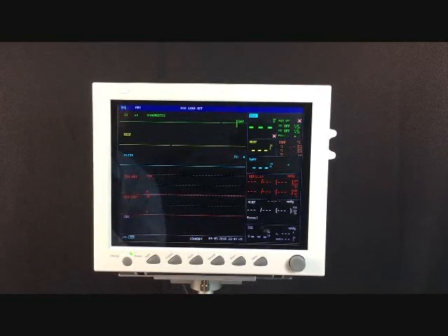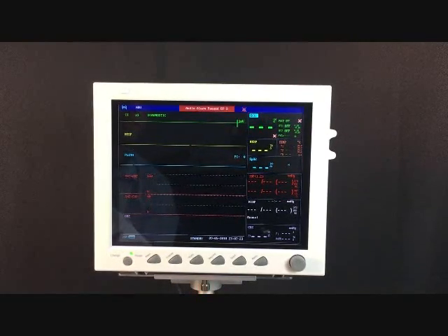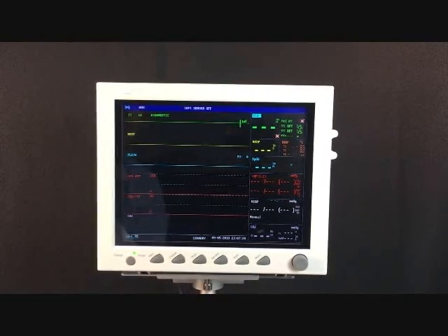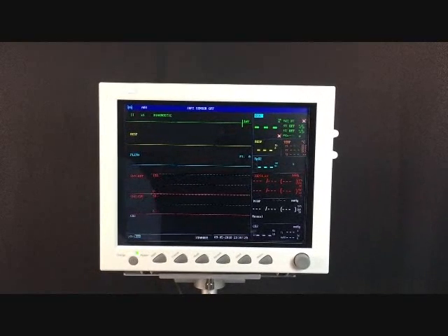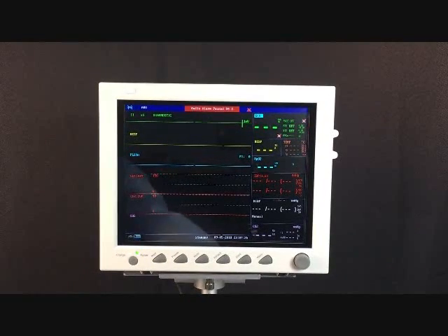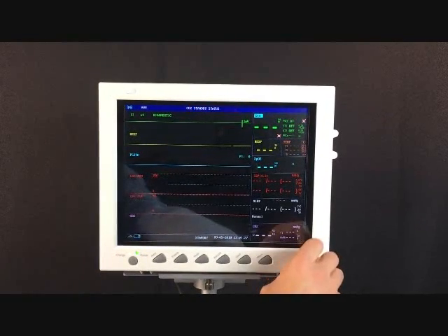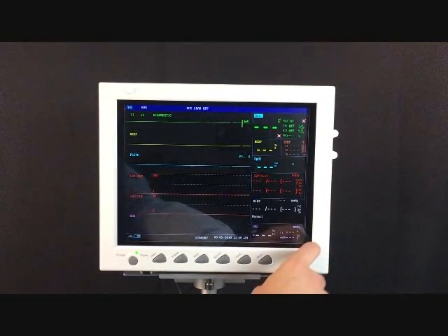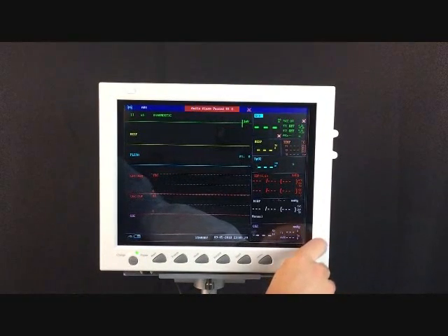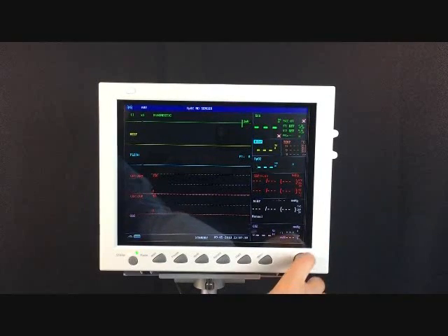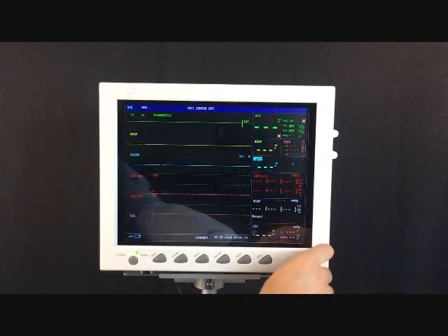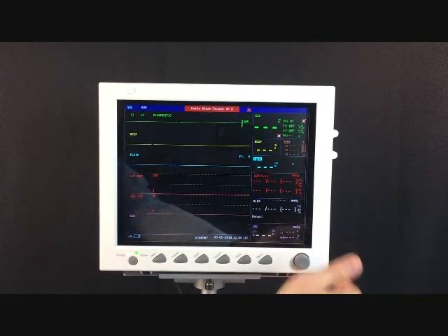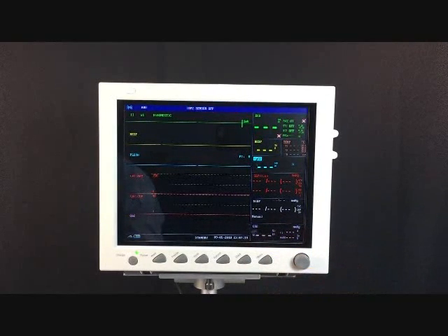Before we go over the main menu, let's take a look at the different areas where you can scroll on the main screen. The main screen is where you'll find things like your ECG readings, your respiration, temperature, SPO2, and so on.